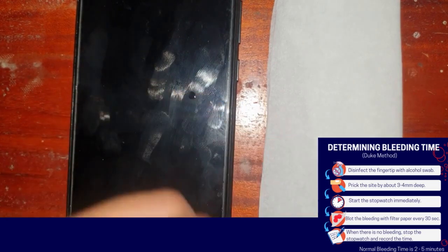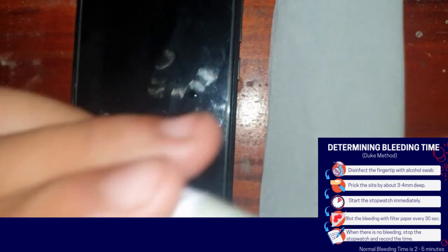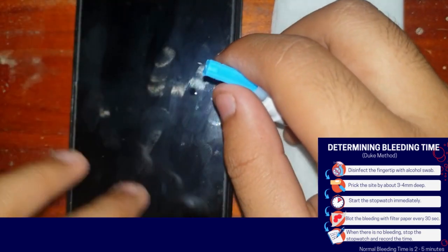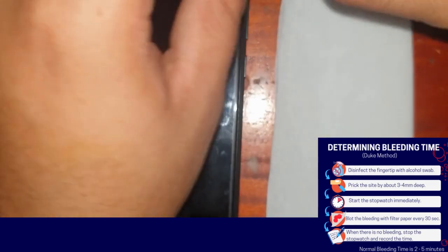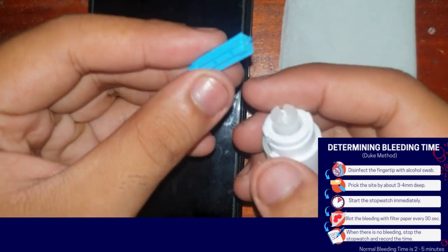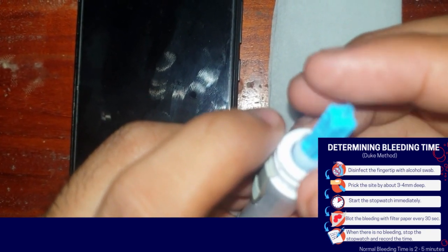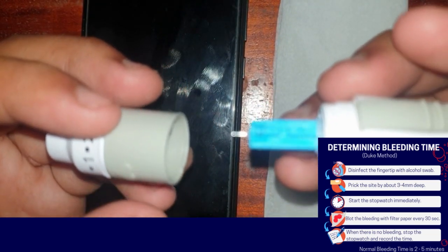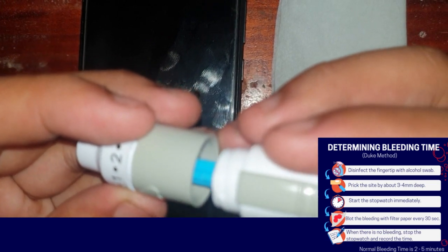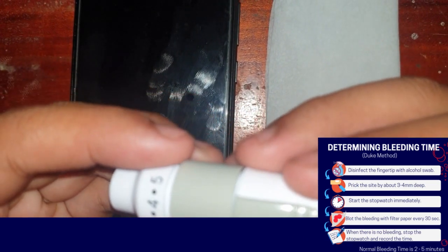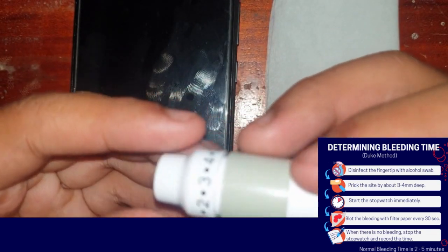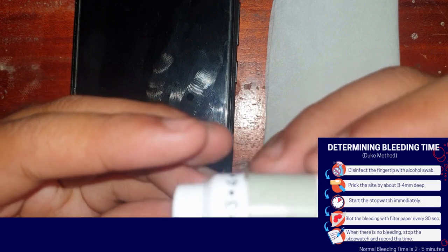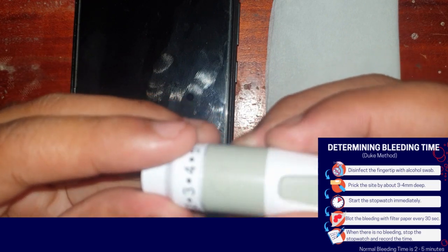So let's continue. We must first disinfect our finger, but since we have a lancet device, we must first assemble it. We need to open it, remove the used needle, take a new one, insert it — don't touch the needle — insert it until it clicks, and then it's already primed. Insert it carefully so the needle won't touch the casing, then set it to your desired depth of puncture. Since our procedure requires 3 to 4 millimeters, I will choose 4 millimeters.